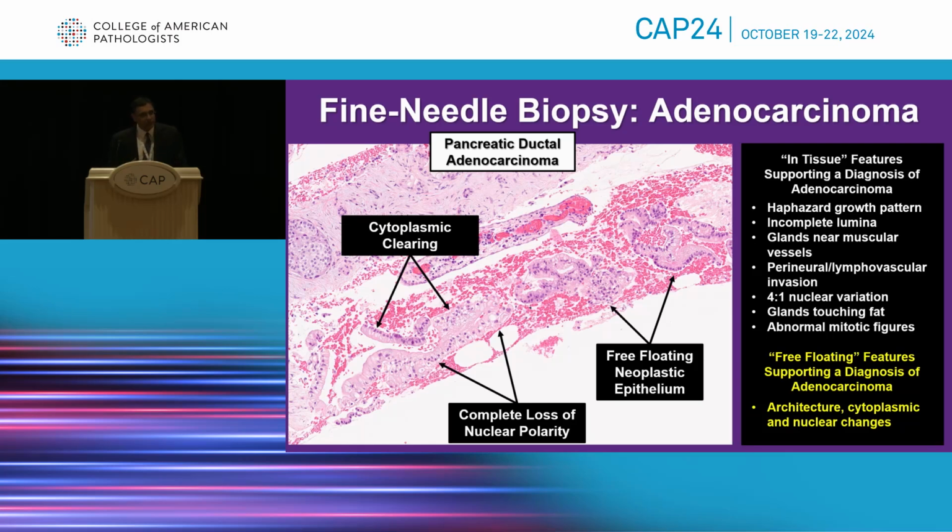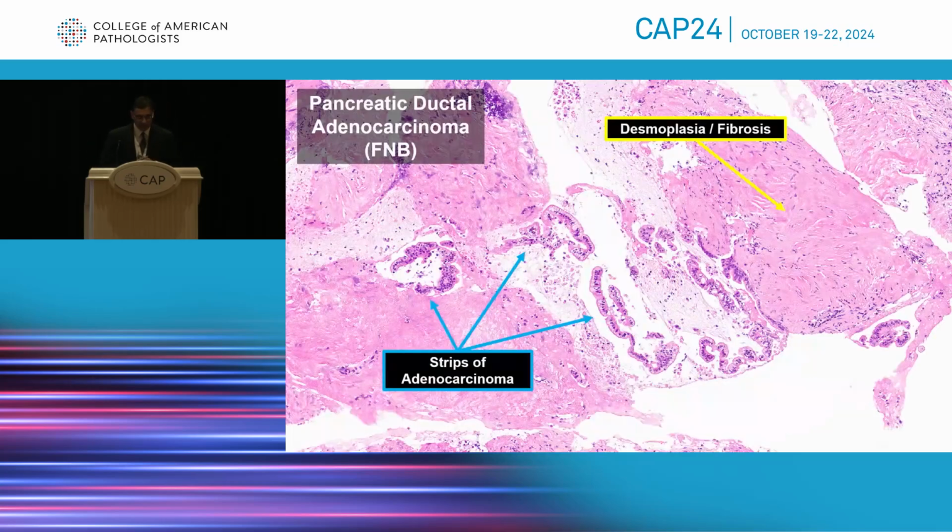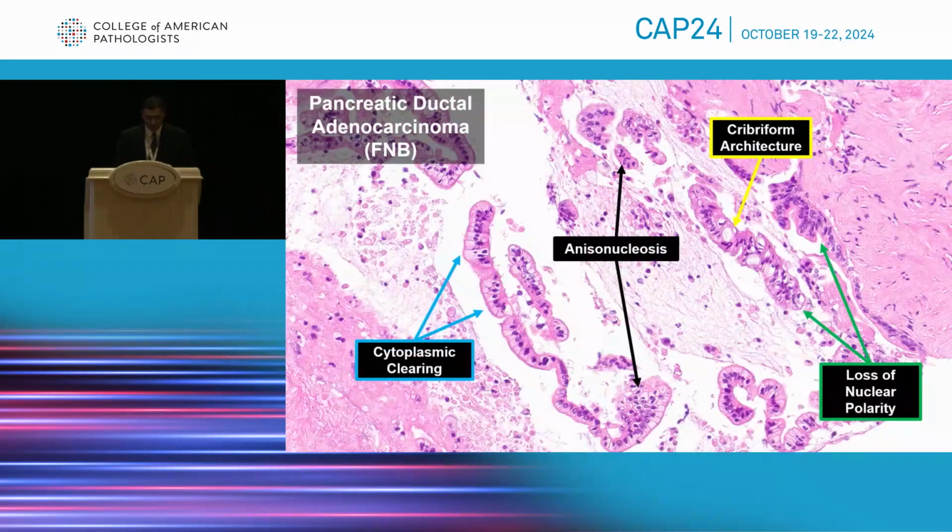This isn't surprising, as adenocarcinoma is often discohesive, often loses E-cadherin expression in fact, and likely reflects loss of the cell adhesion mechanisms that allow cell migration and tumor invasion. Therefore, not infrequently, you can get some fantastic tissue cores, but the adenocarcinoma itself is not even present in any of them, but rather found at the periphery of these fibrotic cores themselves.